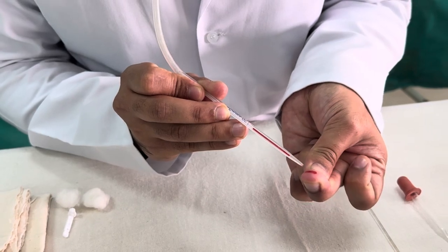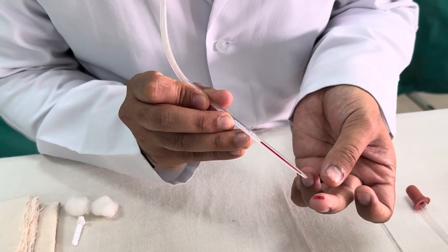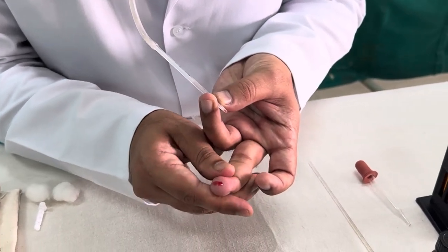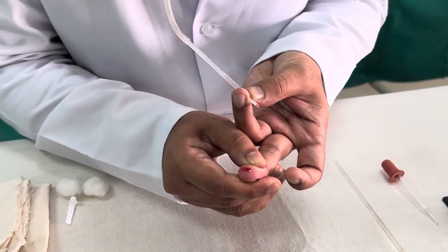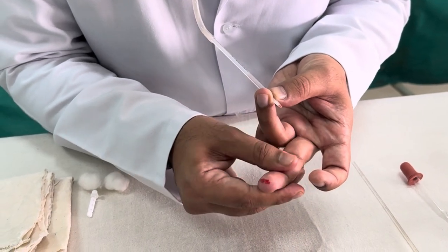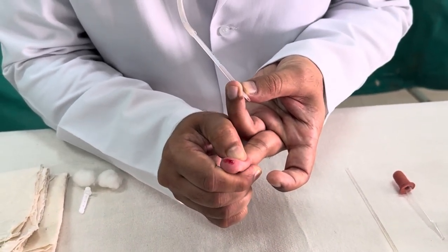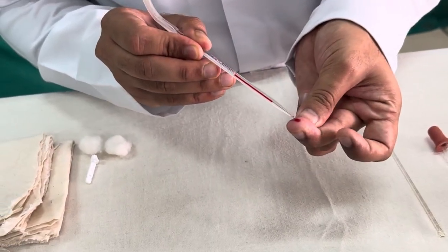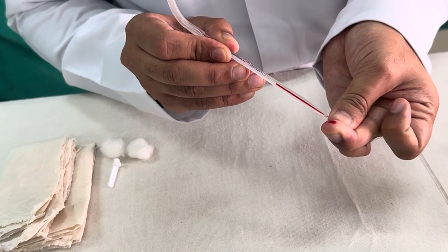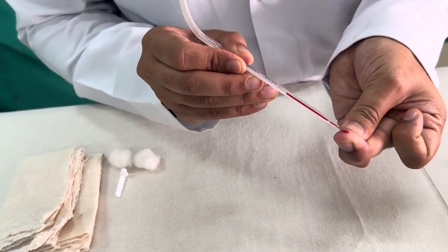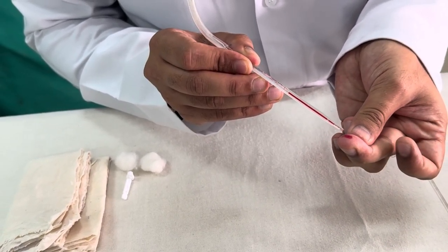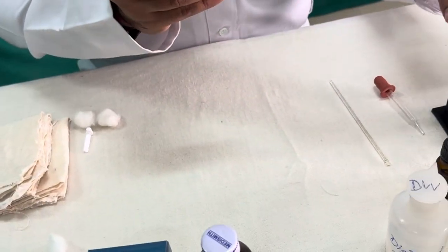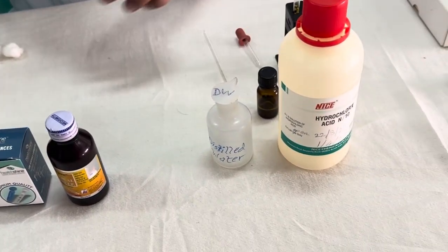So see, there should not be - if at all you are getting air drops you have to just discard it and you have to recollect it. We are getting bit error but it is okay, you have to recollect the blood. So the blood is not coming now, we have to recollect the blood. Actually we should not do it in one setting only. But still, we have made it and we have collected the blood up to 20 microliter.